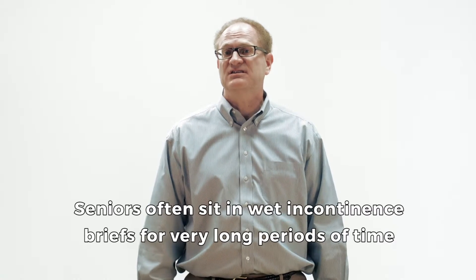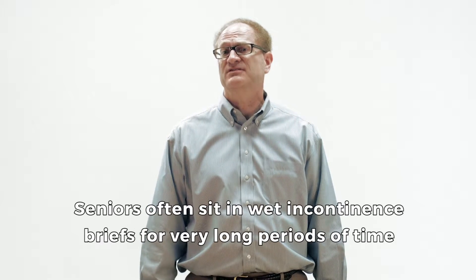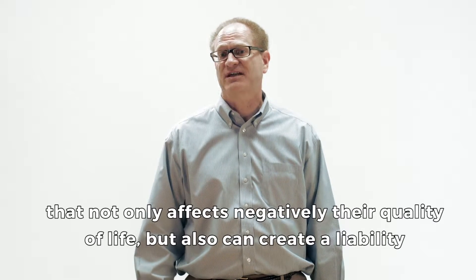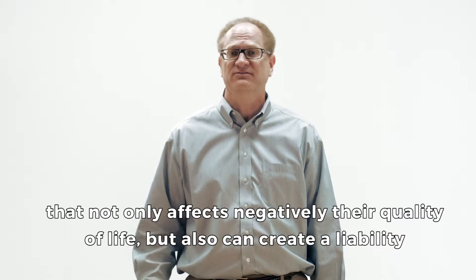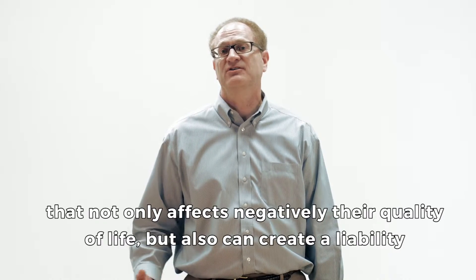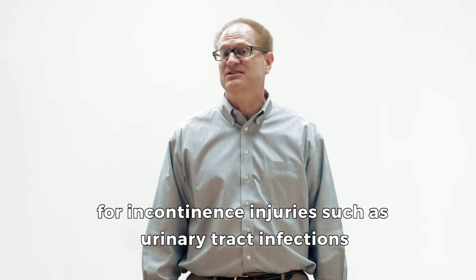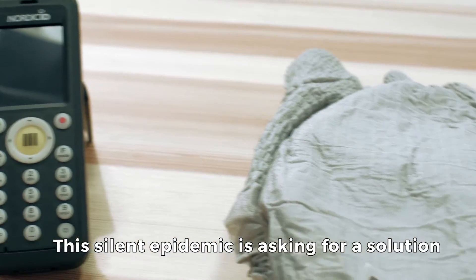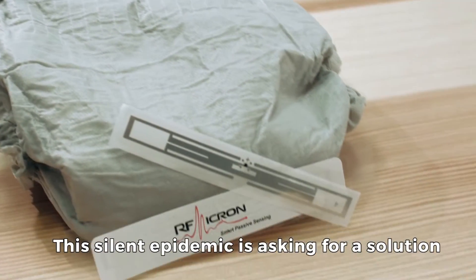Seniors often sit in wet incontinence briefs for very long periods of time, which not only negatively affects their quality of life, but also creates a liability for incontinence injuries such as urinary tract infections. This silent epidemic is asking for a solution.